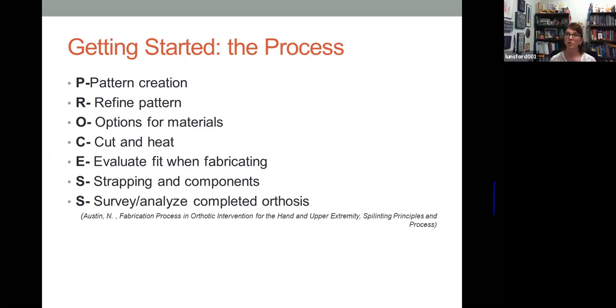Some of the materials that I refer to can always be used by every age, but the thermoplastic materials, we just have to be cautious of with the kiddos, right? Because kids don't think twice about moving and pulling things off and shifting them around into the spaces that they're not supposed to be. If someone isn't monitoring them, then it can become problematic in terms of harming the surrounding tissues or not doing what they intended to do. So yes, those materials would be appropriate.